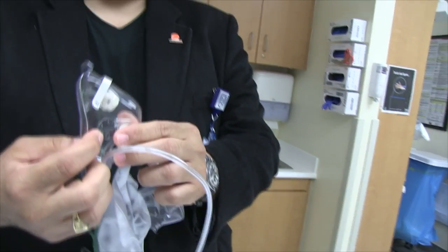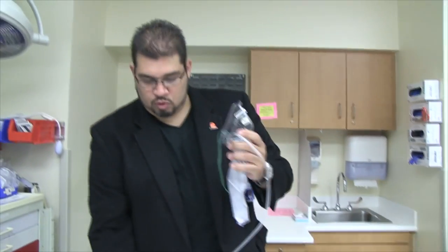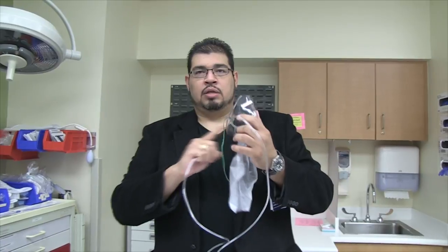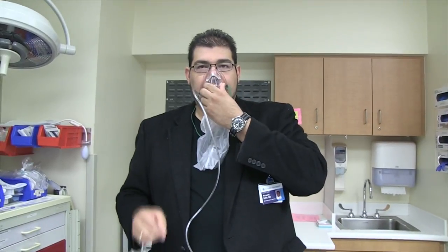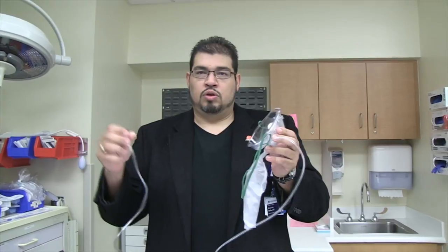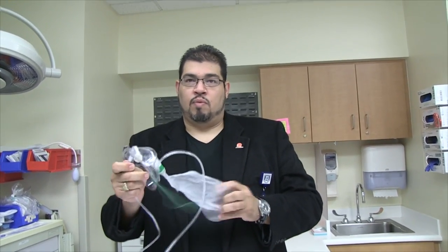But you still have another side that does let air in, and that's a safety mechanism, because if I don't hook this up to oxygen, and I have no oxygen going into the mask, if I have a true non-rebreather, right, if I have discs on both sides, then I'm actually rebreathing CO2. You don't want to do that if you lose your oxygen supply, if somebody steps on the line. So it's a safety mechanism, but it's not a true non-rebreather.